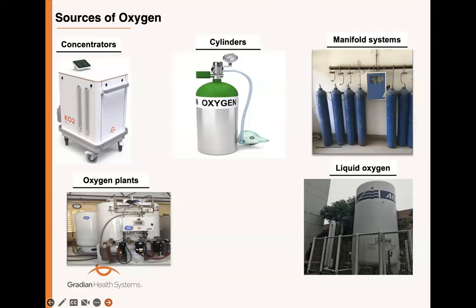And in other places, we can have a manifold system, which is a set of cylinders connected to the hospital through the pipeline to the wards and theaters.